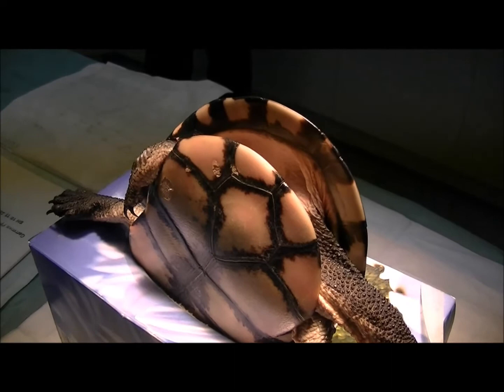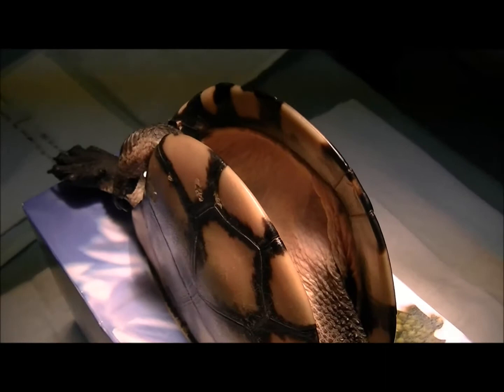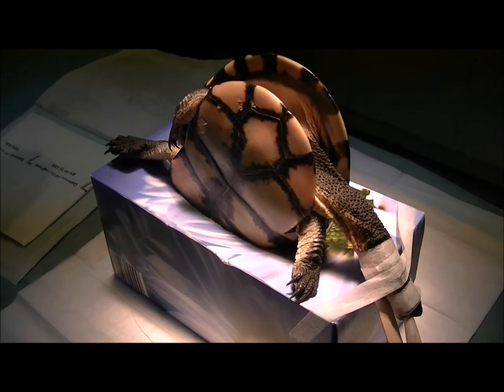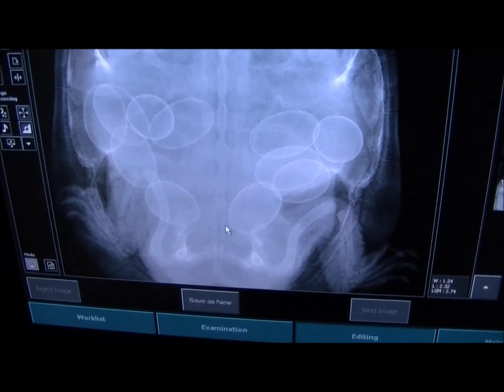The reason we've got her in this position is that she has been hit by a car, and she's actually got a fractured right humerus — the upper arm bone — which is down in here. I'll show you the X-ray of that in a second, but we're going to attempt to pin that today to get it well aligned. We've put her in this position because it's what we need to access that site. We'll show you the X-ray and then we'll go to surgery.